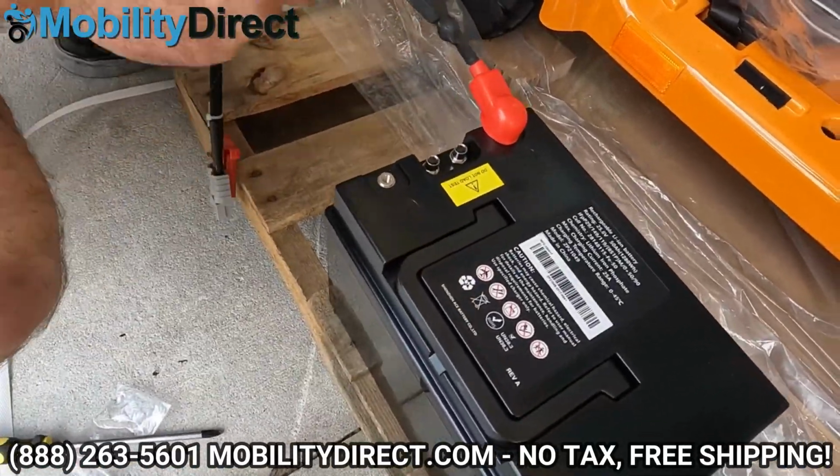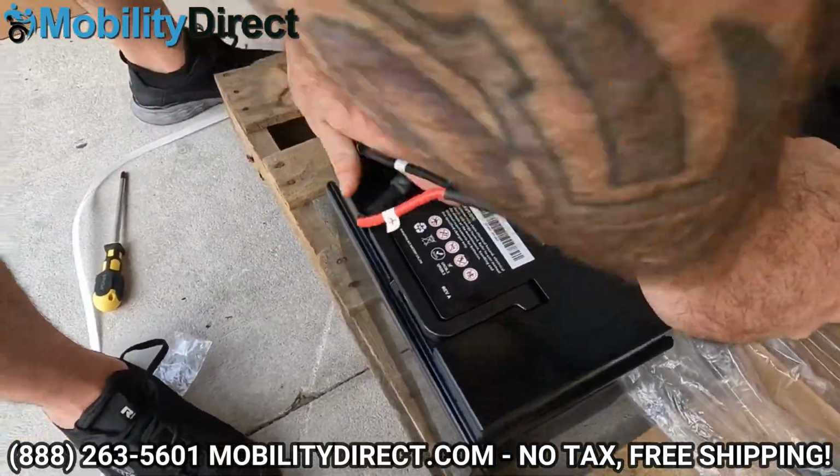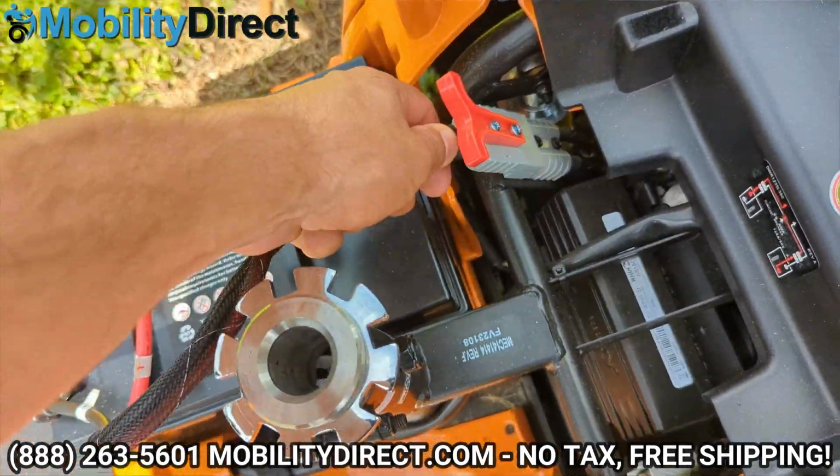Accessing the battery compartment, you just learned how to do it. So if you need to change your batteries, you go in there, take the red and the black cable off the battery, and put the new one back in exactly as it was wired with the old one.